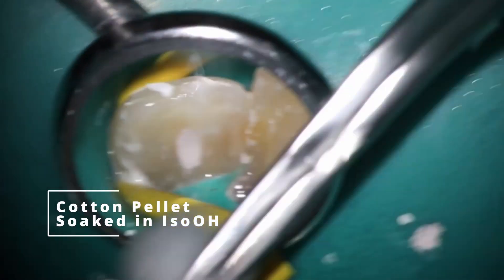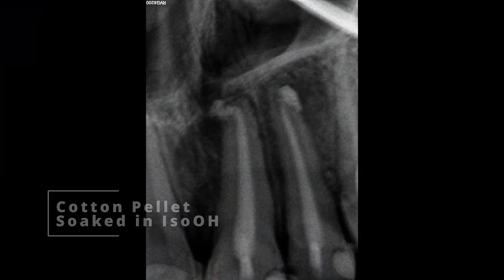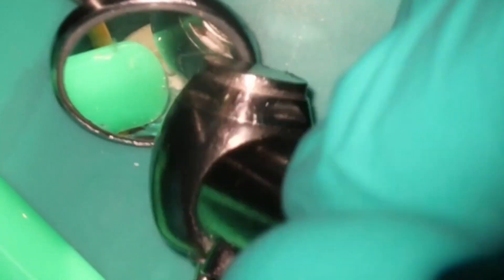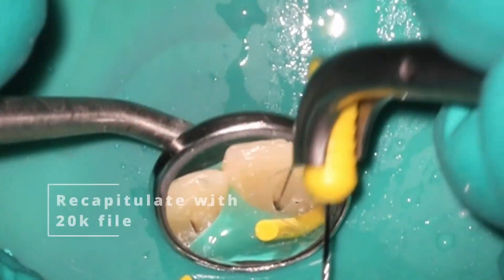Then I'm going straight in with Cavit for these. One thing you can do to make Cavit harden up a little bit faster is to use the cotton pellet soaked in isopropyl alcohol. So that's what we look like — got some calcium hydroxide at the end of the tooth, very happy with that. She comes back a month later and we're going to reaccess. So drilling back through that Cavit. I hate IRM — I am very much a big fan of Cavit, it's a much better product.